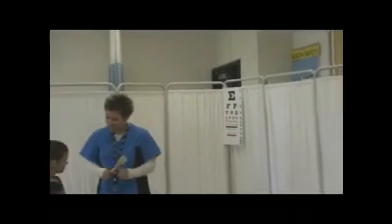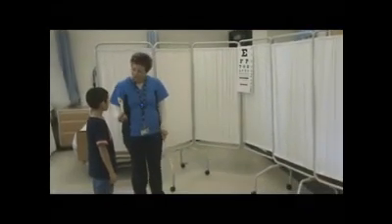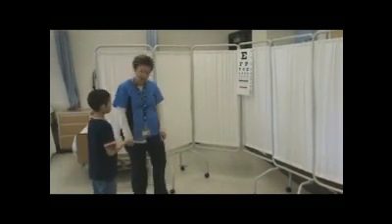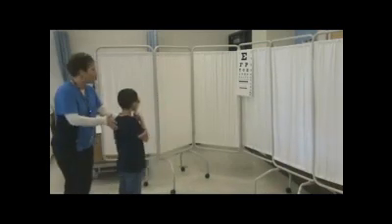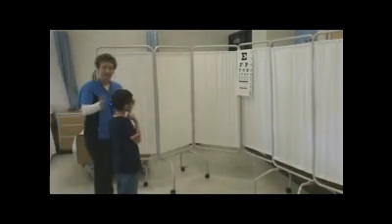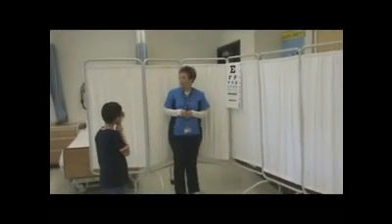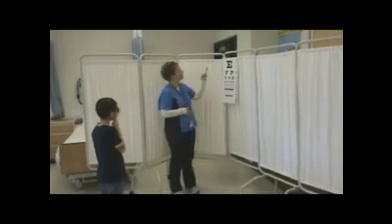So I'm going to bring Matteo in, and we are going to show you an example of an assessment. Welcome, Matteo. I'm going to have you hold the eye patch and cover one eye. Okay? I would like you to stand right here. This is my 20-foot marker. I'm going to point to the letters, and I want you to read the letters for me.